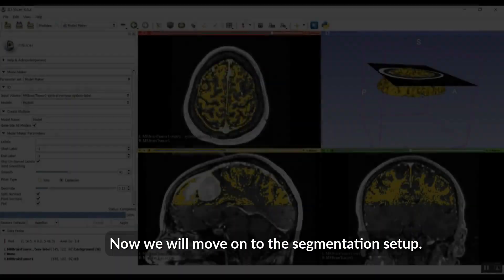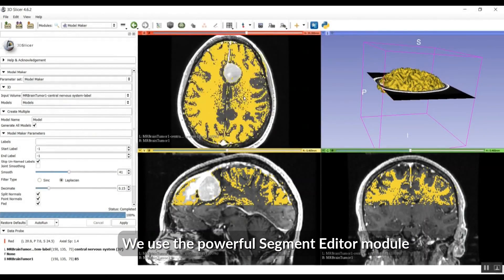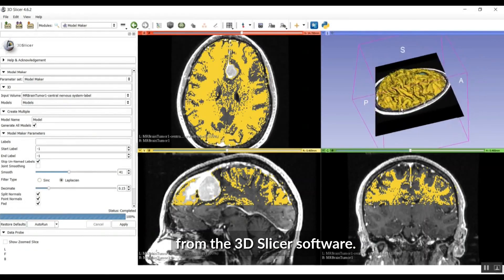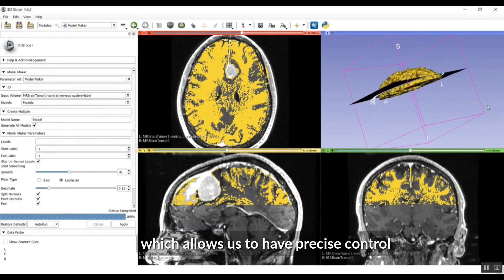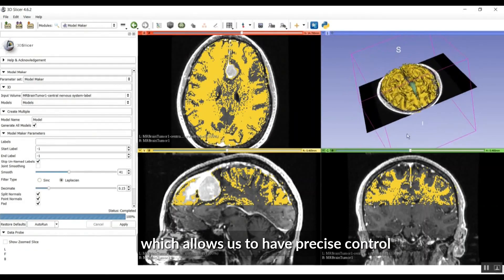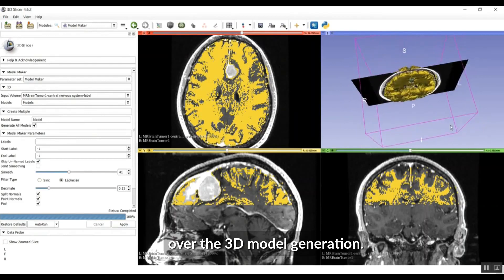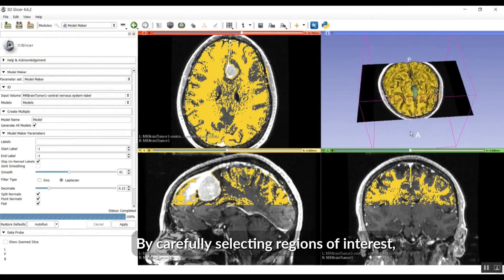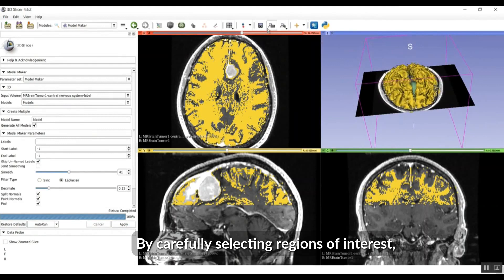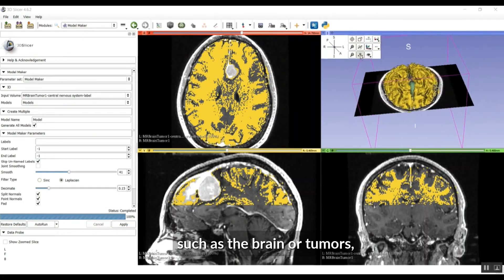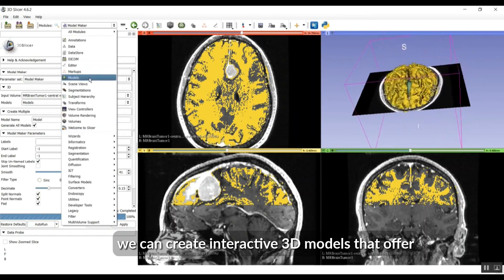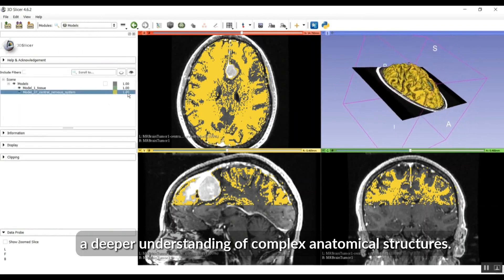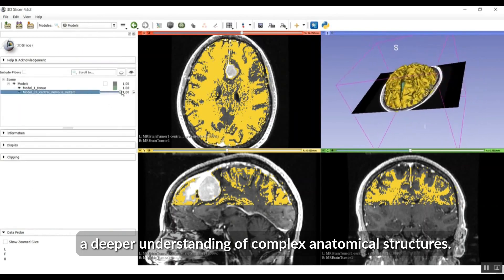Now we will move on to the segmentation setup. We use the powerful segment editor module from the 3D Slicer software, which allows us to have precise control over the 3D model generation. By carefully selecting regions of interest, such as the brain or tumors, we can create interactive 3D models that offer a deeper understanding of complex anatomical structures.